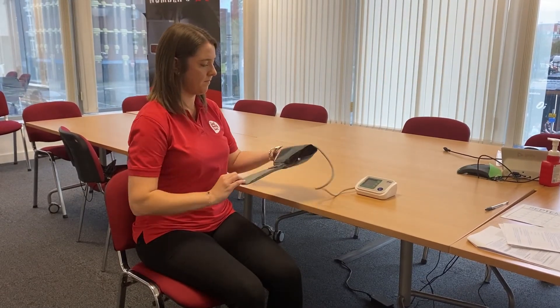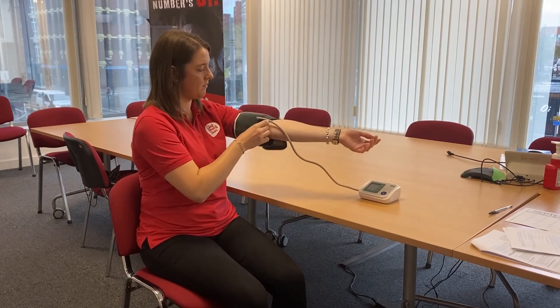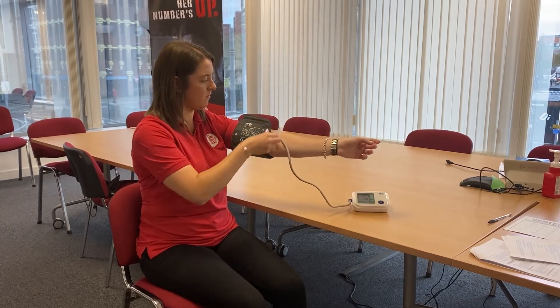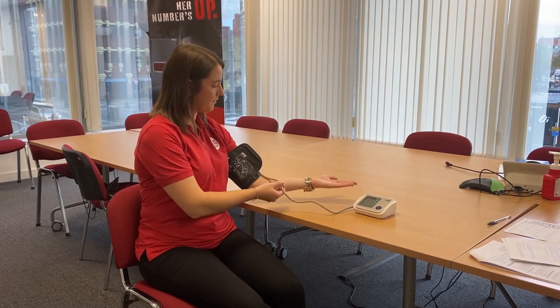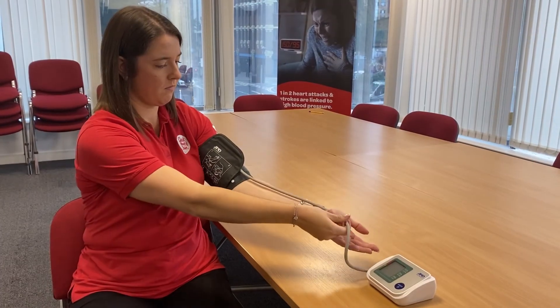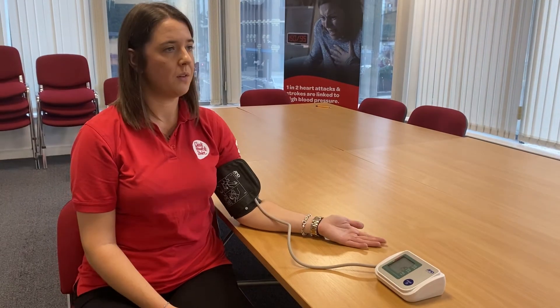To begin your blood pressure check, place the cuff on the upper arm with the plastic tubing facing down towards the hand. The cuff should be about two centimeters above your elbow to make sure it can detect the artery in your arm just under the skin. Rest your arm on a solid surface such as a table so it is at the same level as your heart, with the palm of your hand resting up.